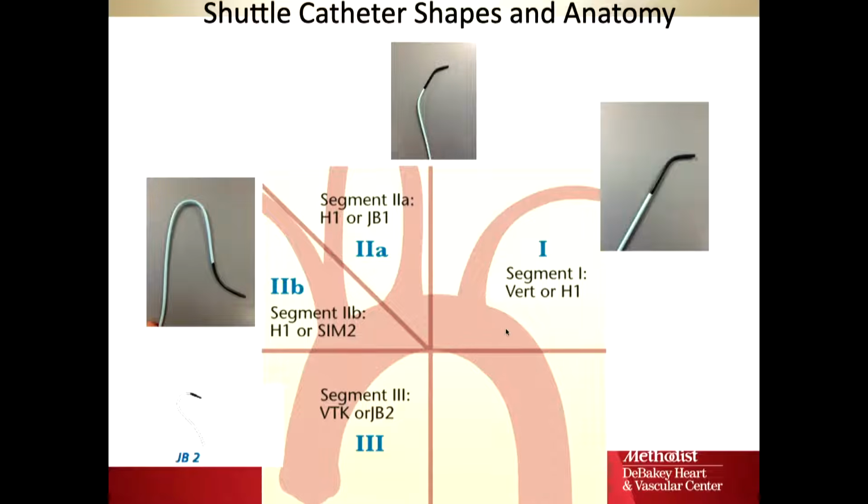When you bring a wire up here, and you'll see this perfectly in that model, you use the outer wall of the aorta to drive a wire from here. Sometimes we curve it around in the aortic valve. And then the catheter drives up around that aortic valve. You pull the wire back and this will reform. The whole idea is that the tip of this catheter seeks around the outer wall and pops into this.